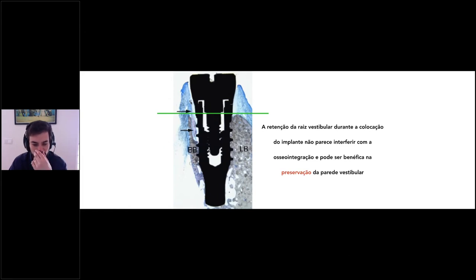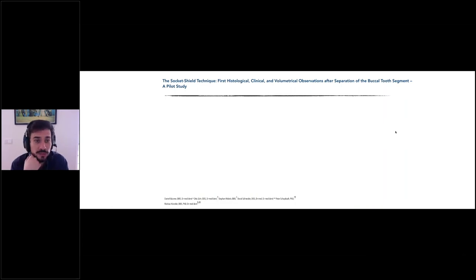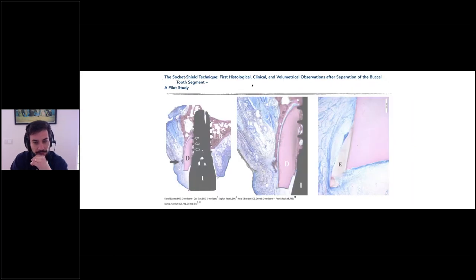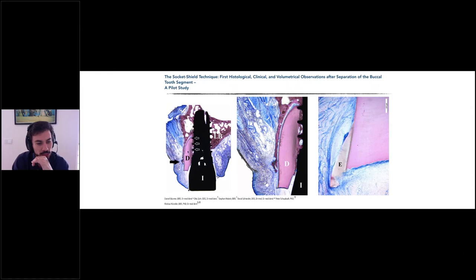So therefore they concluded that the intentional retention of the buccal part of the root will not interfere with the osseointegration of the implant and will maintain the buccal volume of our patients, maintaining the periodontal ligament and the irrigation of the bundle bone. The study has gone further, and they did animal study two, the group of Hürzeler and the group of Daniel Baumer. The first histologic, clinical, and volumetric observations. And once again, they left the buccal part of the root, as you can see here. You see new bone behind, between the root and the implant surface. And you see that at this time, the root is higher than the bundle bone, okay? We're going to discuss this in a few minutes.